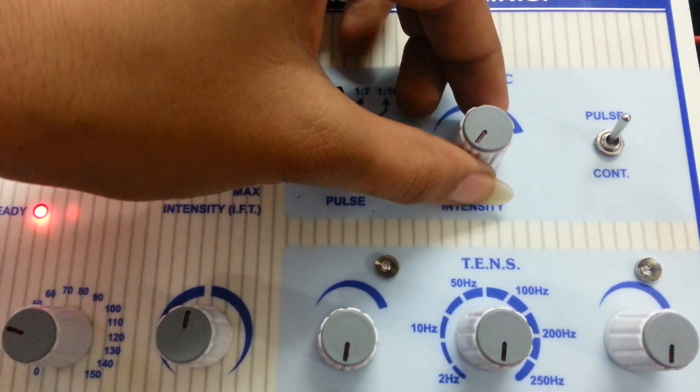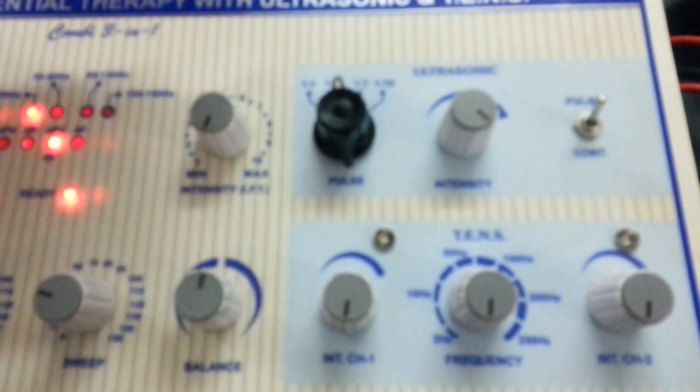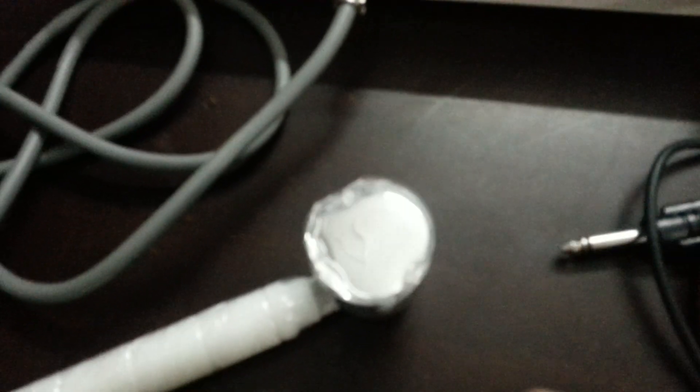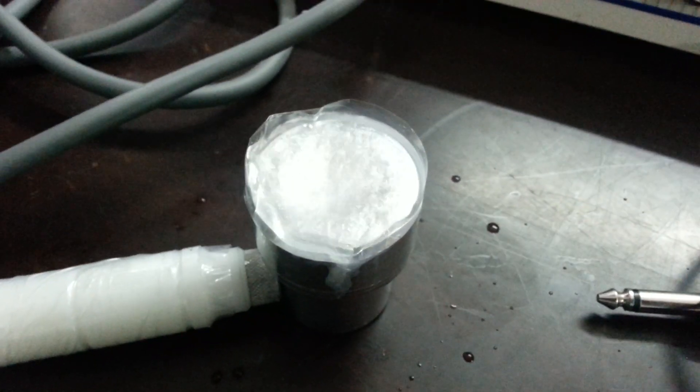Now increase the intensity as per your need. After treatment is completed, make the intensity knob at zero.